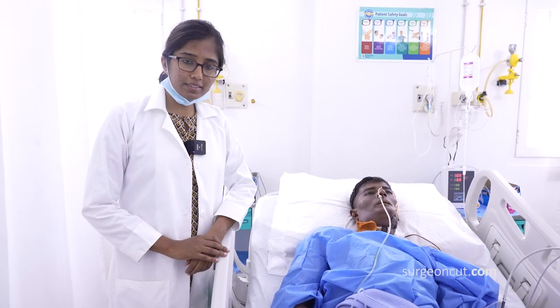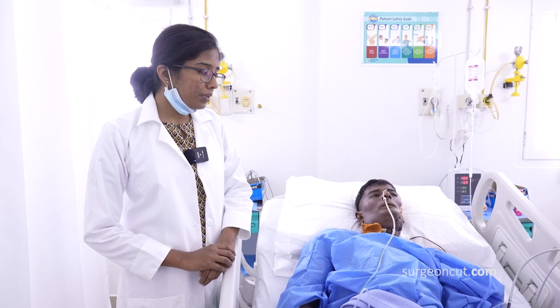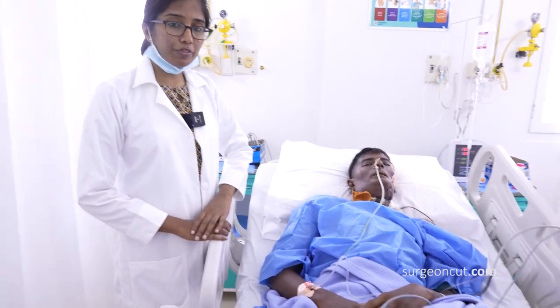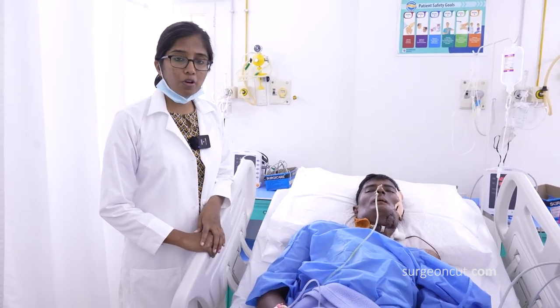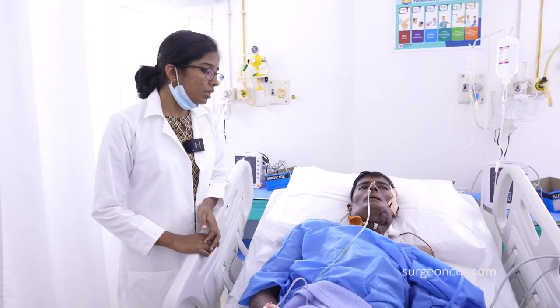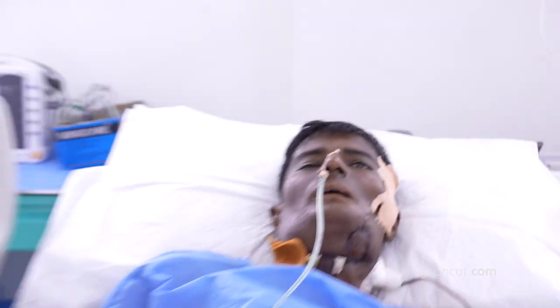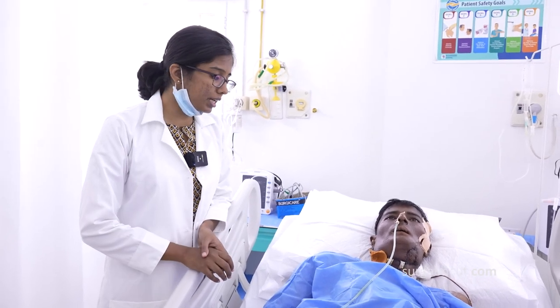Alright, so this is day 5 post reconstructive surgery. We've done free fibula flap reconstruction and also used a PSI, that is a patient specific implant, for reconstructing the left mandibular defect. This patient had undergone a hemiglossectomy, hemimandibulectomy 2 years ago. PET scan has been taken, he's cancer free. He wanted rehabilitation for the left lower jaw so that we can restore his function. He can eat, chew properly even from the left as well as the right side.